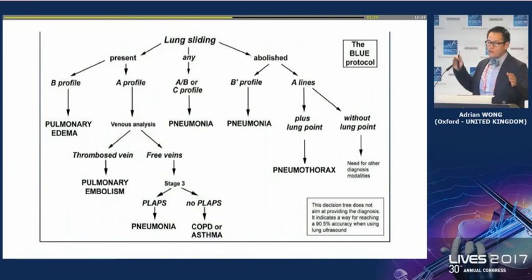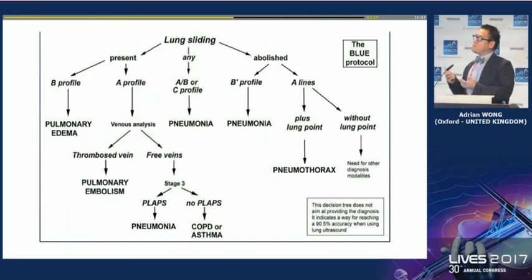I've already shown you this, or it's already been shown earlier. This is the blue protocol. You can just Google it. I've had the privilege of speaking to Daniel Lichtenstein. He has dedicated his entire professional career to developing lung ultrasound.